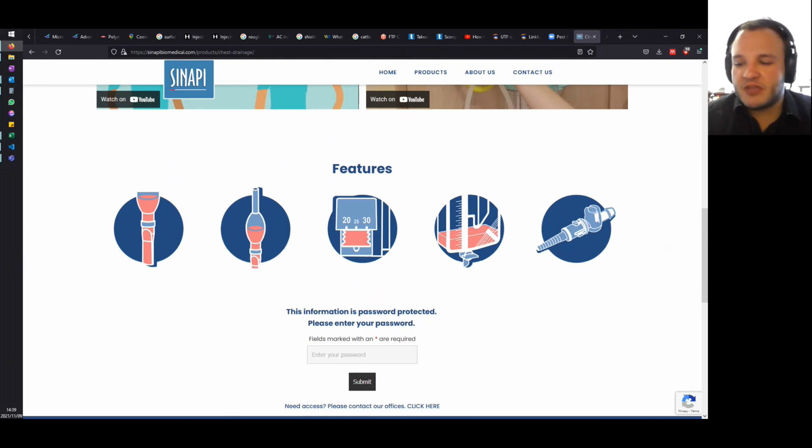And again, it allowed us to develop quite quickly and easily, because it eliminated the costs of iterating, as you could do it all on the computer without actually having to go and buy and mold various devices and various components.